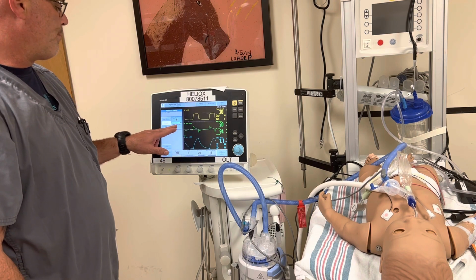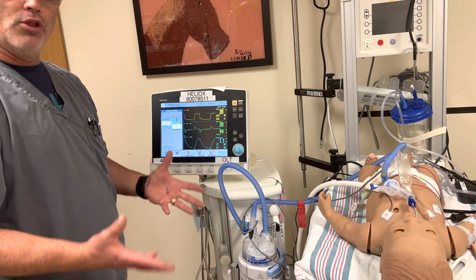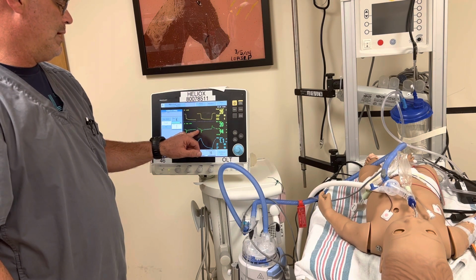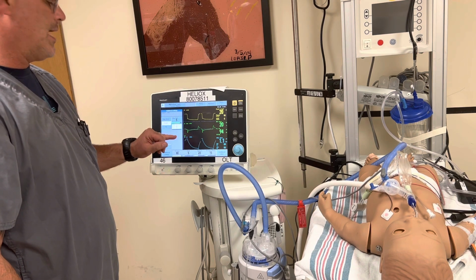Well, we want our pressure support breaths to give that same benefit, to fill the lung as much as it can, and use all the lung during the pressure support breath, so we get a lung that's equally expanded. We identify that because the vent doesn't need any more positive flow in inspiration. Well, that's what occurs when you have a percent cycle at 1.